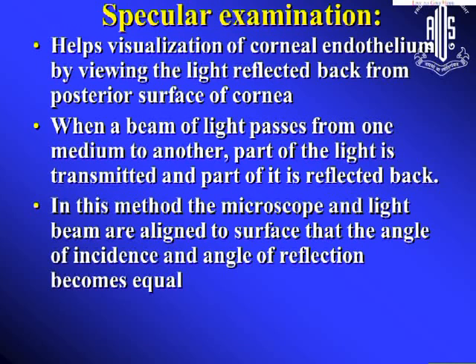Both systems have to be properly aligned. Between the observation system and the illumination system, the angle has to be close to 60 degrees. The light goes from here, and the patient is looking straight ahead, bisecting your observation system and illumination system. Then use a small parallelopiped with a slightly narrow beam, about 2 millimeters, and you will see the corneal parallelopiped. You will also see a reflection onto the cornea of the bulb of the illumination system. Now, the moment you align this to this, you come close.